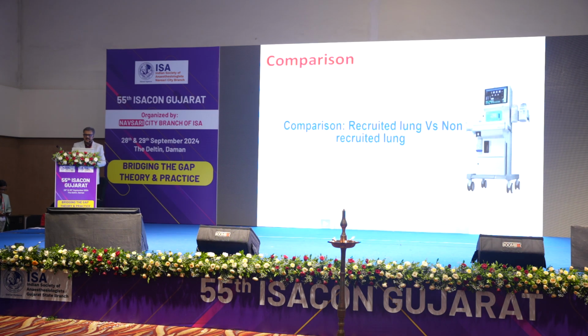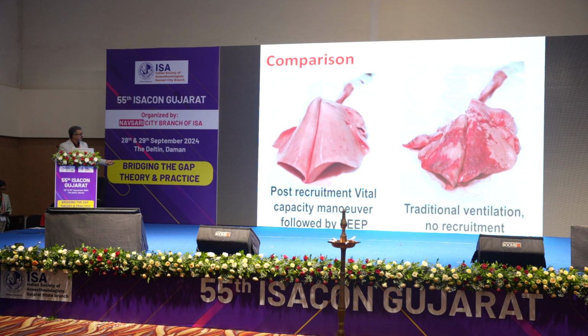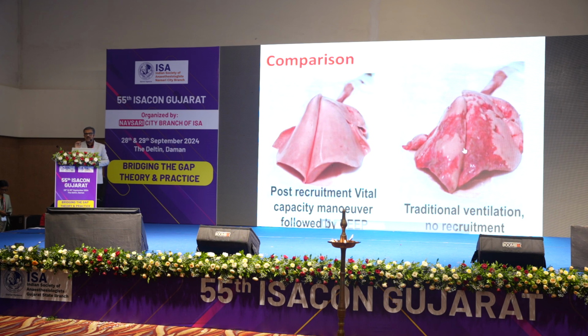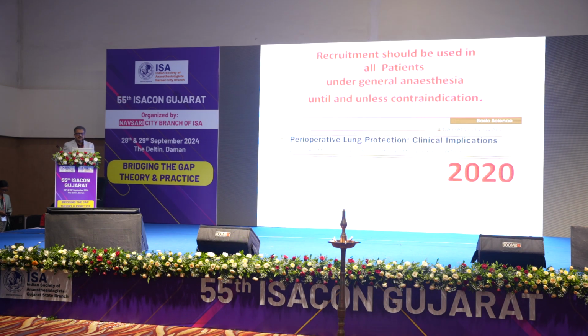So this is the comparison of recruited lung and non-recruited lung. We should have this type of clear lung in the intraoperative period, not an atelectatic lung. This can lead to postoperative pulmonary complications. So recruitment should be used in all patients under general anesthesia unless there is a contraindication. And we should have a tailor-made approach for each patient for recruiting the lung.